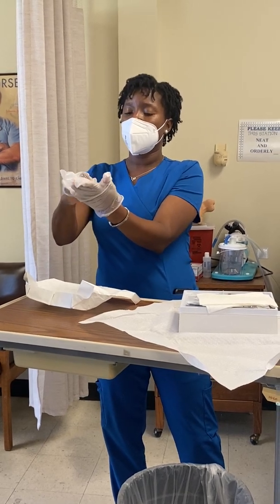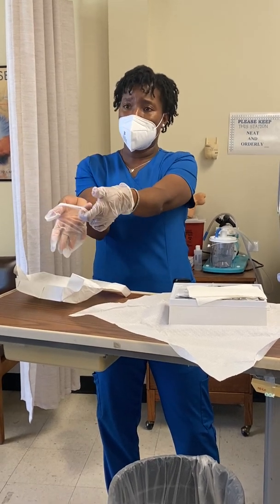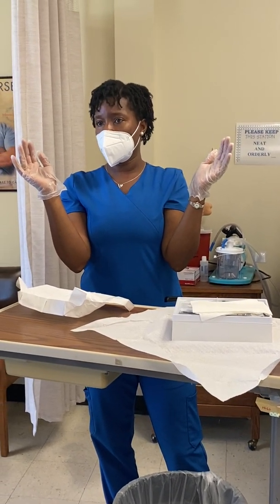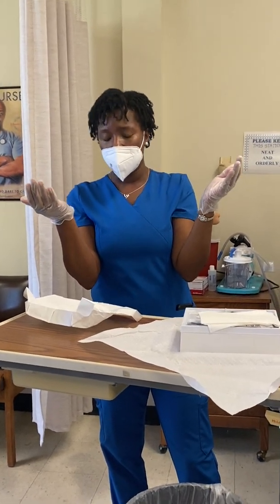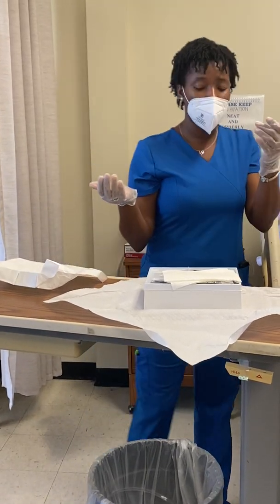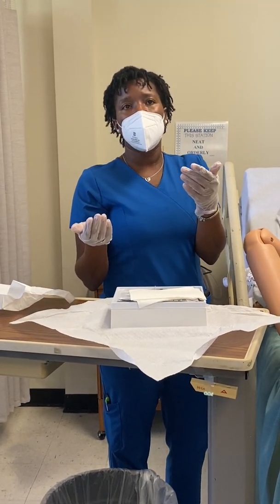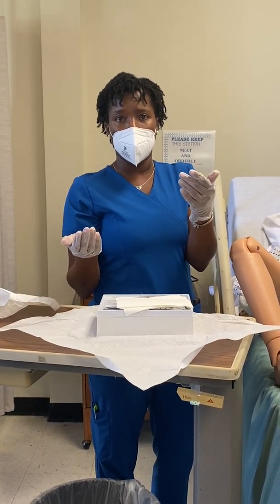But if you can see the difference in these gloves, you guys, these are very thin. And these are a little bit, you see how that hole got in there? So you have to be careful with that. Now, do I have on an adequate pair of sterile gloves? No. If I was doing an actual catheter change, I probably would change gloves. But we don't have the money to do that around here, so we've got to keep going. What if that happens during your competency? You can let your instructor know. We'll see something like that. You can tell us if you feel like you made an error, but you can't do that the whole competency and think you're going to pass.